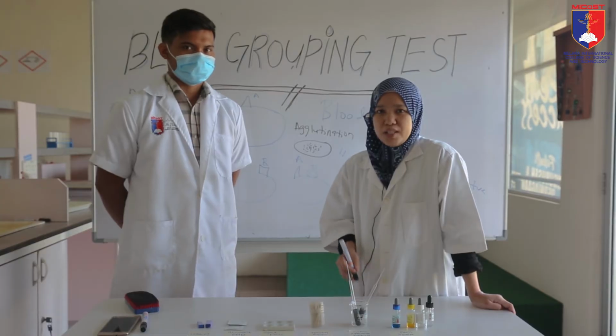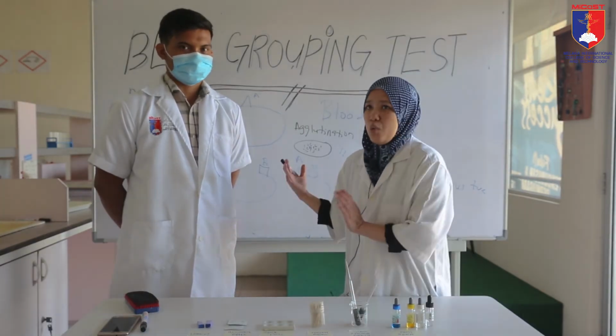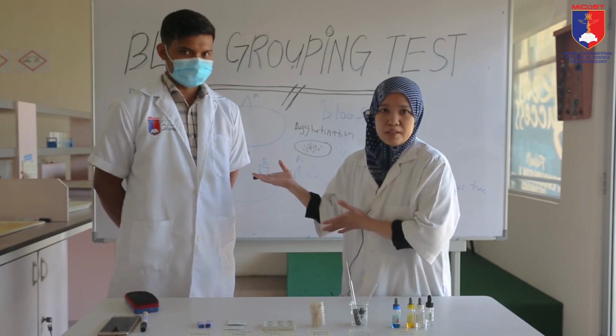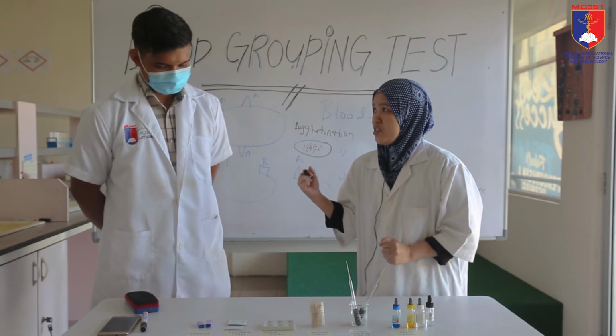Okay, so to proceed with our blood grouping test, I will be assisted by Encik Zul, our lab assistant. Okay, so thank you Encik Zul.